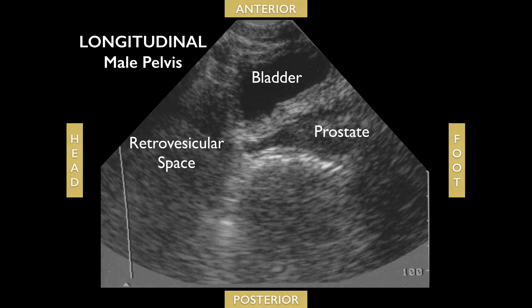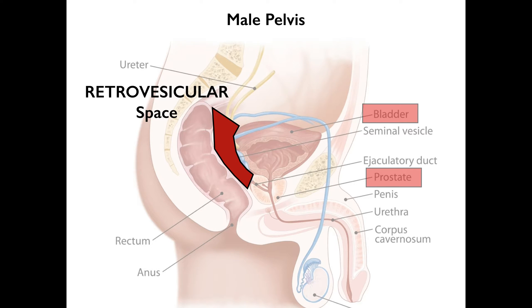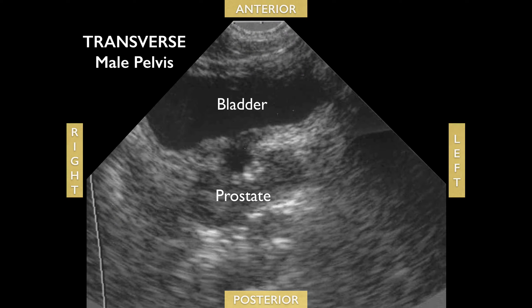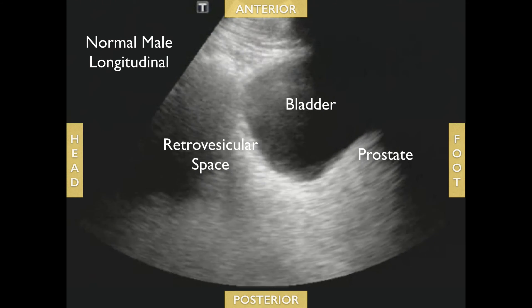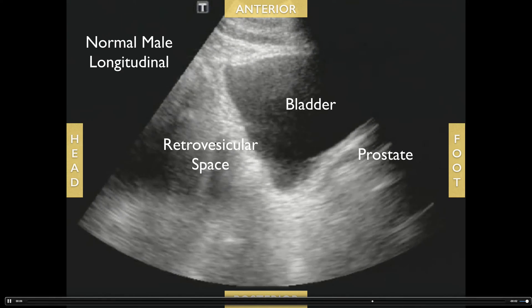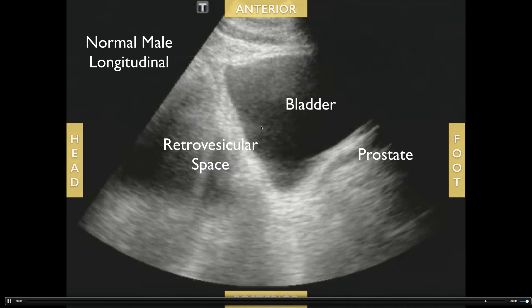You're really looking for fluid just posterior to the bladder and prostate in the retrovesicular space. Draw a line right at the prostate and bladder and look just posterior to that — that's where you'll see free fluid. The longitudinal view is generally better and easier to interpret than the transverse view. Here's a normal male longitudinal view showing the bladder, prostate, and retrovesicular space with bowel gas.